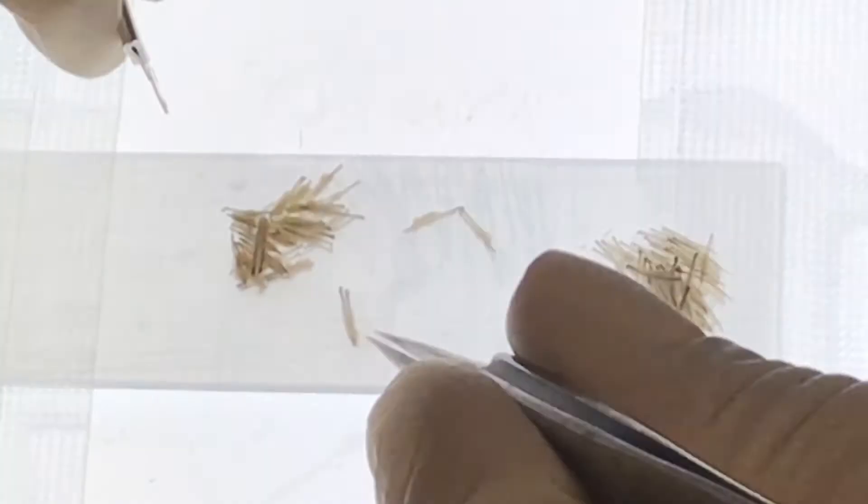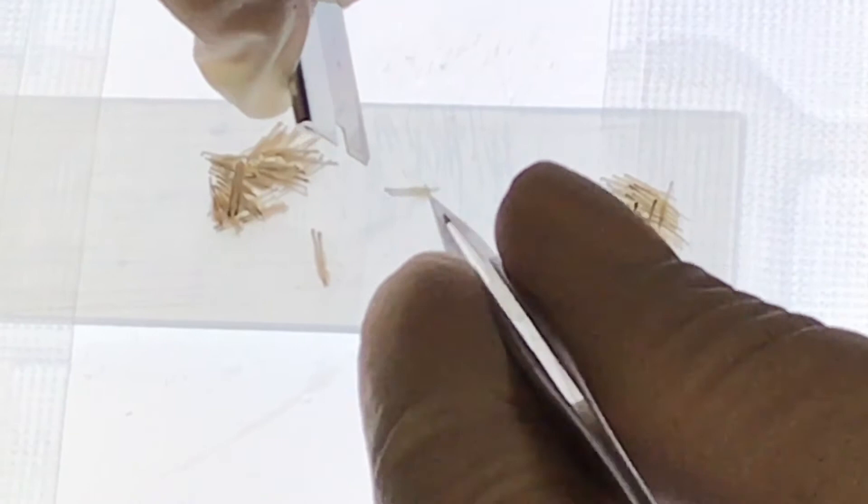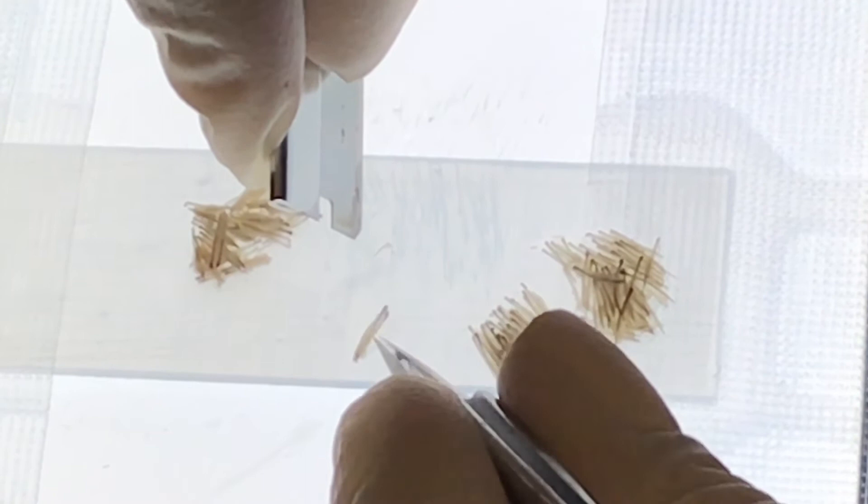At this point we're taking each follicular unit and dividing out the individual hairs. Most people usually have some units that are around two to three hairs per unit. This particular patient is a rare exception and has up to four to five hairs per unit, which means that with every little extraction he gets almost double the amount of hairs compared to the average person.